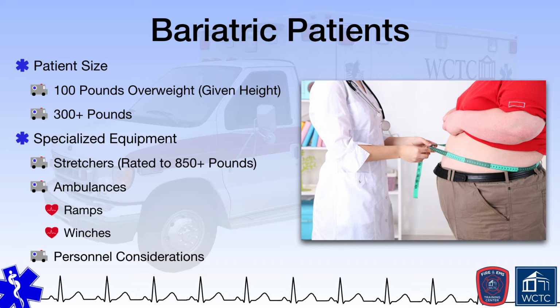Therefore, EMS crews must ensure they have or obtain adequate personnel on scene to lift and move the bariatric patient. Whenever possible, use equipment designed to help lift and move a bariatric patient, such as lift belts or mechanical devices if available. Keep principles of mechanical advantage in mind and always be sure to lift while using proper body positioning and lifting mechanics, as we discussed in a previous module.